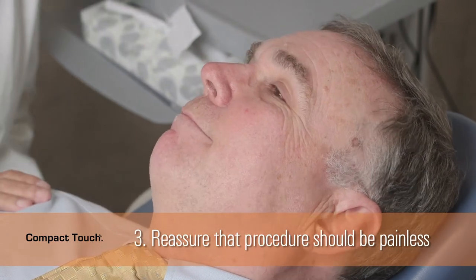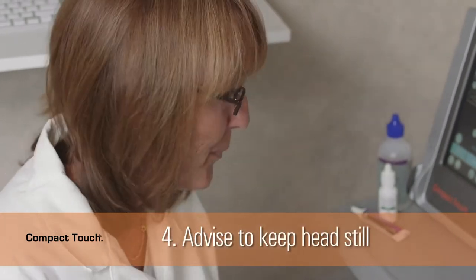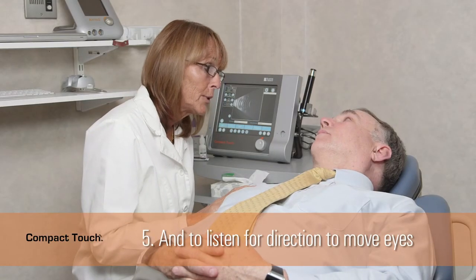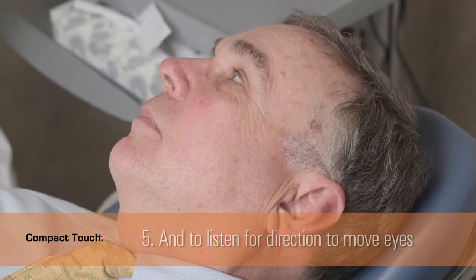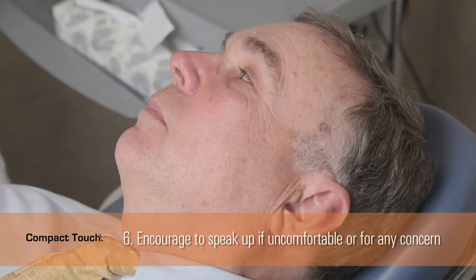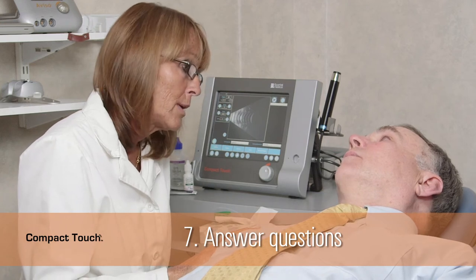However, they may feel the cool, sticky sensation of the gel. Advise them to relax and keep their head still throughout the exam. Let them know that you will be asking them to look up and down and left and right, moving their eyes but not their head, and make sure they know to speak up if they need to for any reason. Lastly, ask if they have any questions before you begin, and address any concerns.